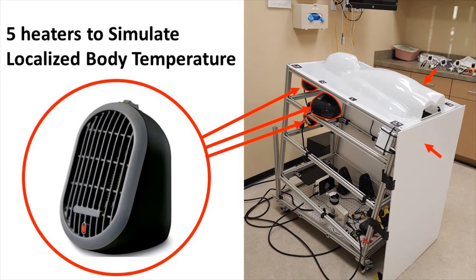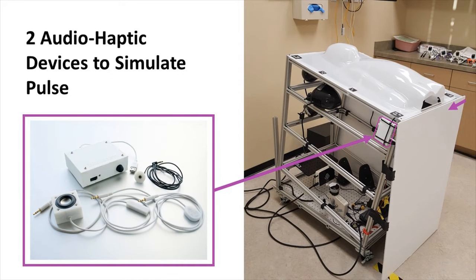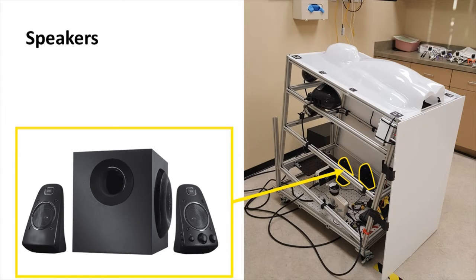Five personal heaters are positioned at different body parts to simulate localized body temperature. For example, the head can feel warmer to touch than the hands. Two audio haptic devices simulate pulses from under the shell. A speaker outputs the patient's speech.